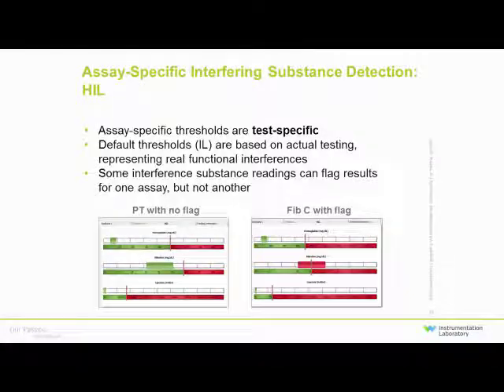And then some of you who are running a TOP now will know you can go into test details. What you will see there, for each test, you can't really read it, but that is hemolysis, that is bilirubin, and that's your lipemia. These lines here are your thresholds for each one of those tests, and this green area here is the value.